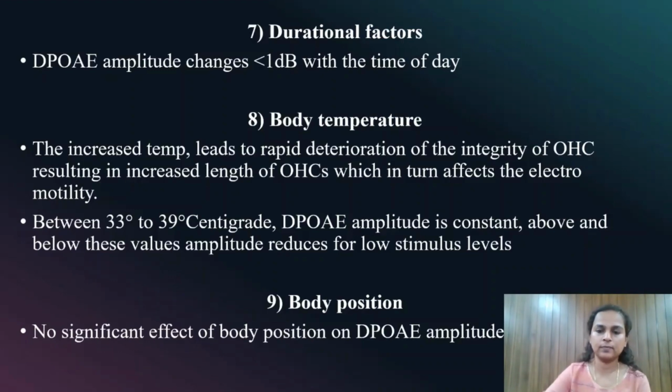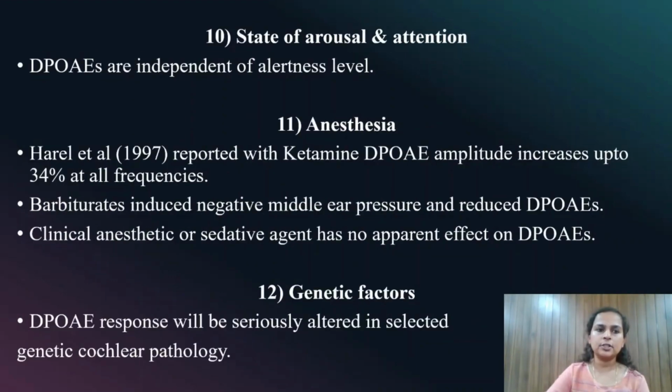State of arousal and attention: DPOAEs are independent of alertness level and anesthesia. With ketamine, DPOAE amplitude increases up to 34% at all frequencies. Barbiturates induce negative middle ear pressure and reduce DPOAEs. Clinical anesthetic or sedative agents have no apparent effect on DPOAEs.